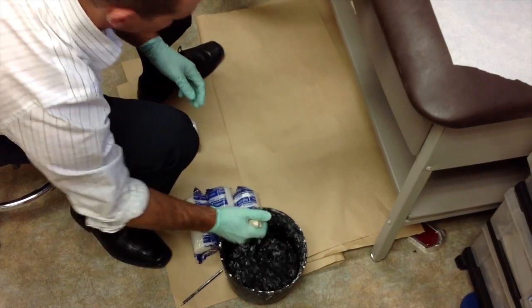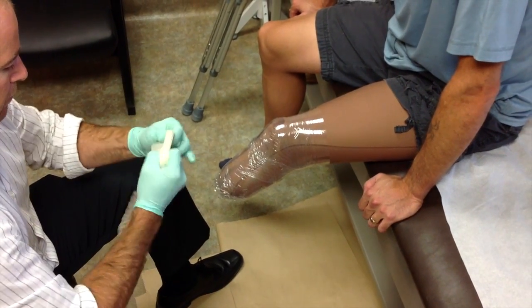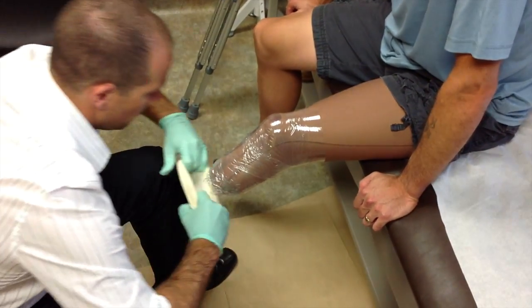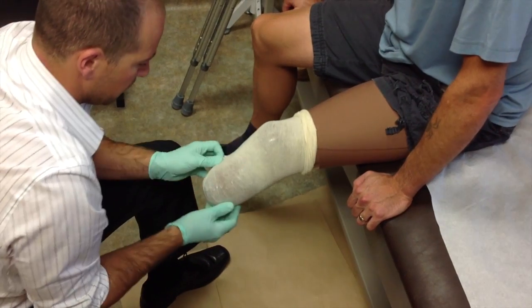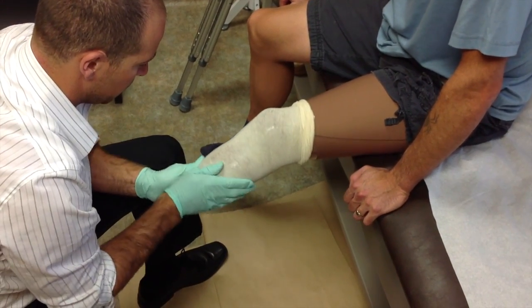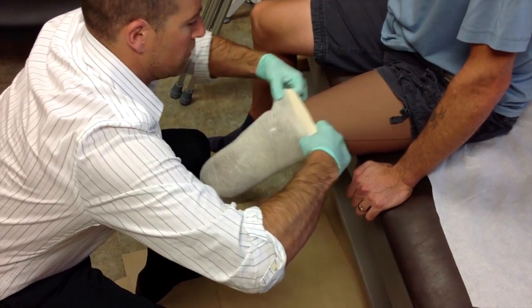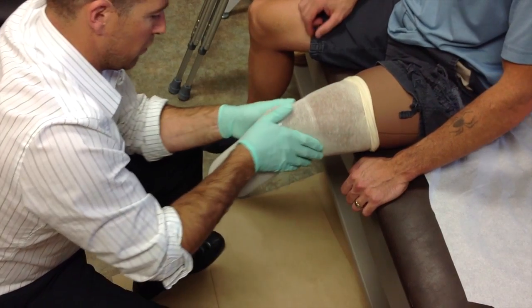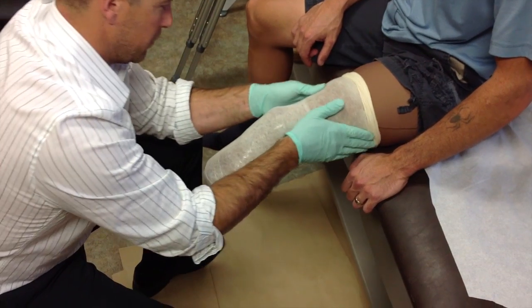The practitioner then takes a piece of cotton or nylon stockinette, wets it, applies it to the residual limb, and takes care to remove all of the wrinkles and make sure that it's not twisted. Remember, you want to think of the casting procedure sort of like the foundation of a house — it's very important to start with a sure foundation, so setting up the casting procedure appropriately and taking your time is very, very important.